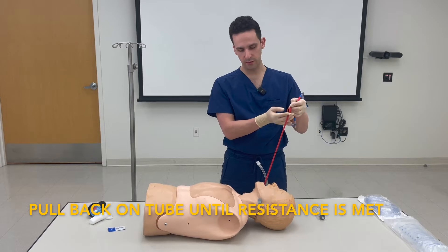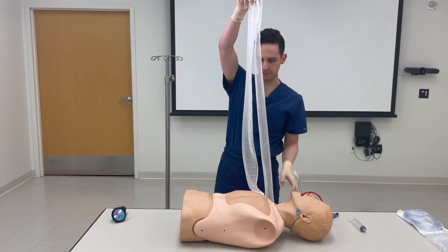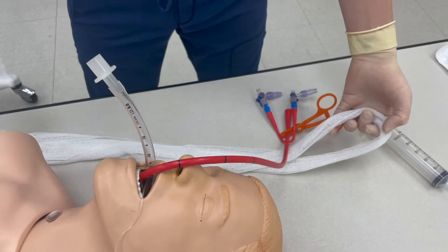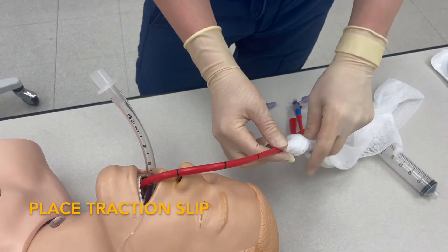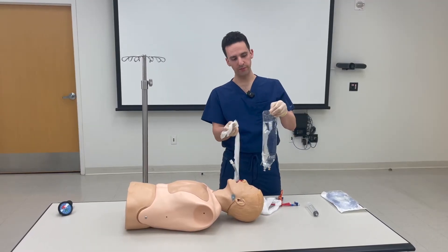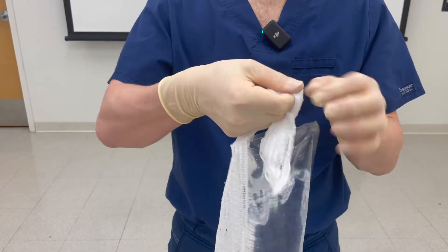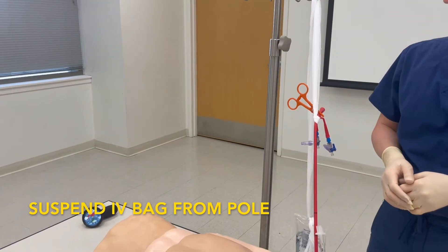Take your gauze roll, unfurl it, and fold it in half. Taking the looped end of your gauze roll, pass it behind the Blakemore, and then the loose ends should pass through. This is your traction slip. Take your one liter bag of fluid, pass your loose ends through, and tie a knot. Hang it over your IV pole and allow it to hang to gravity to provide traction.